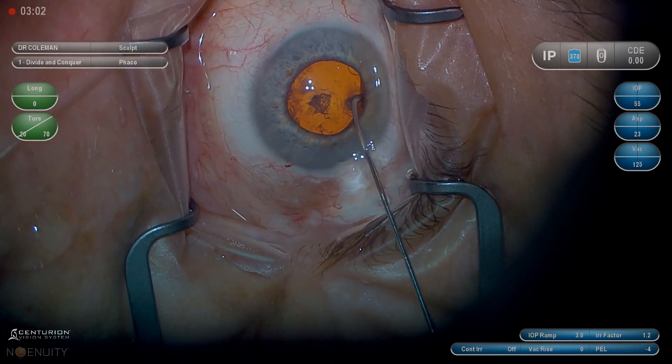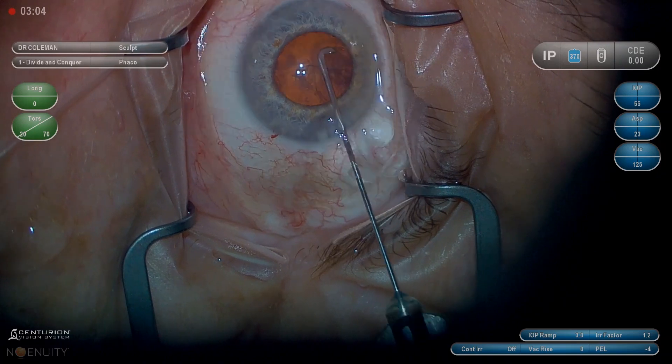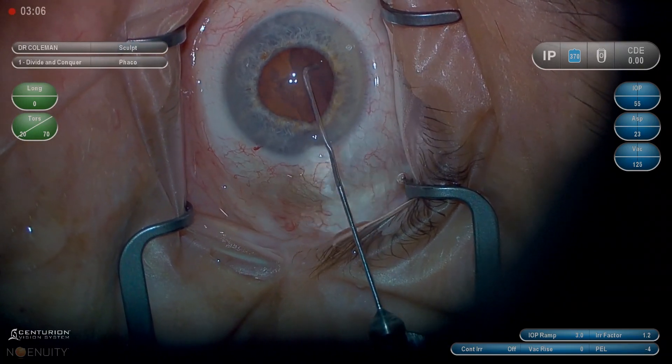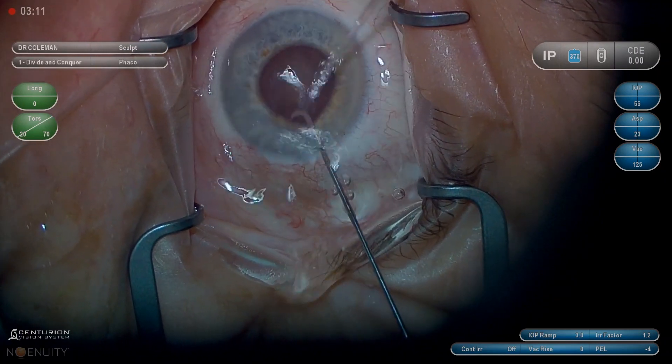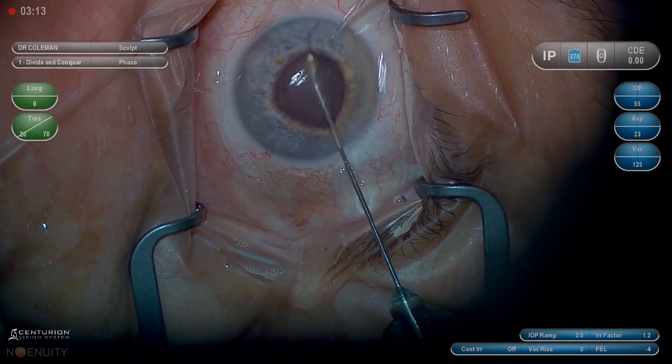Sometimes you do see it and it's okay, but I think it makes you more likely to end up with the nucleus out in a big epinuclear shell that's a little dangerous to get with the phaco and a little inefficient to get with the IA, so it can slow you down.